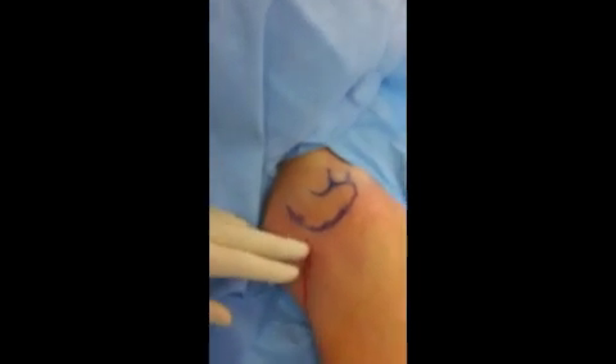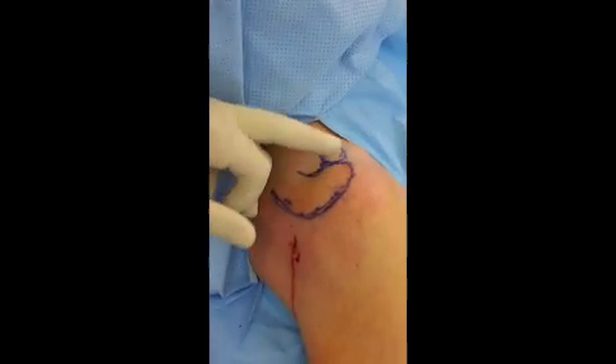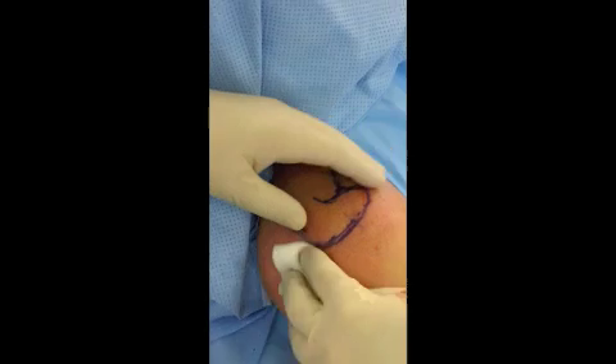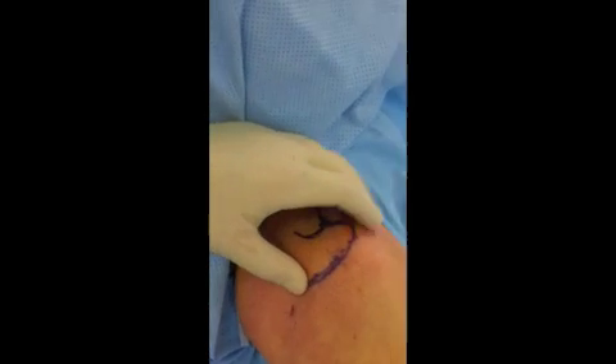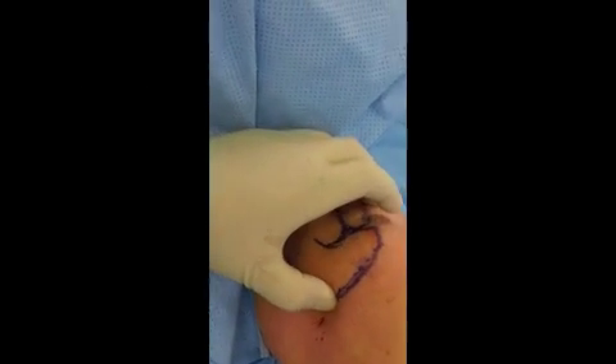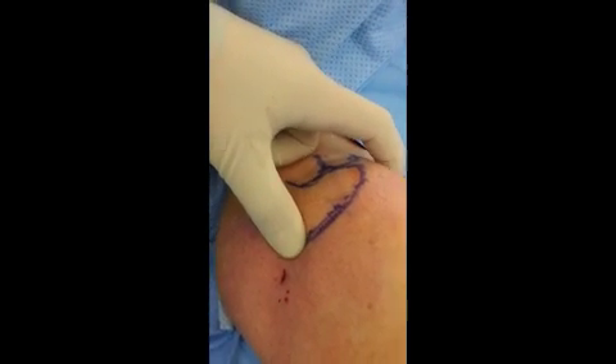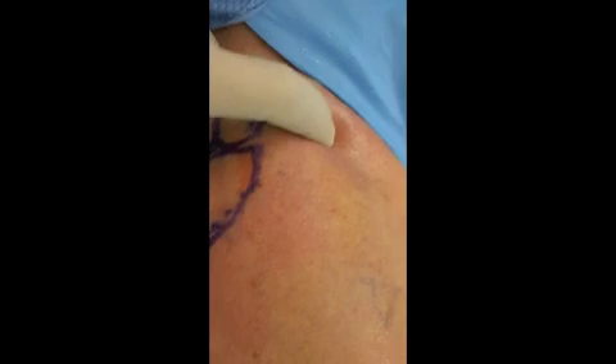This is the outline of the acromion, as well as the clavicle and the acromioclavicular joint. To inject the glenohumeral joint, simply feel the acromion. You can feel the firmness and then feel the coracoid, as you can see from anteriorly with the index finger.